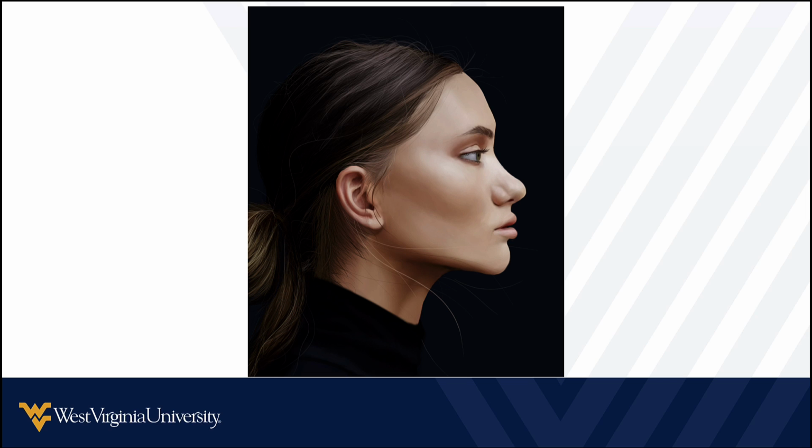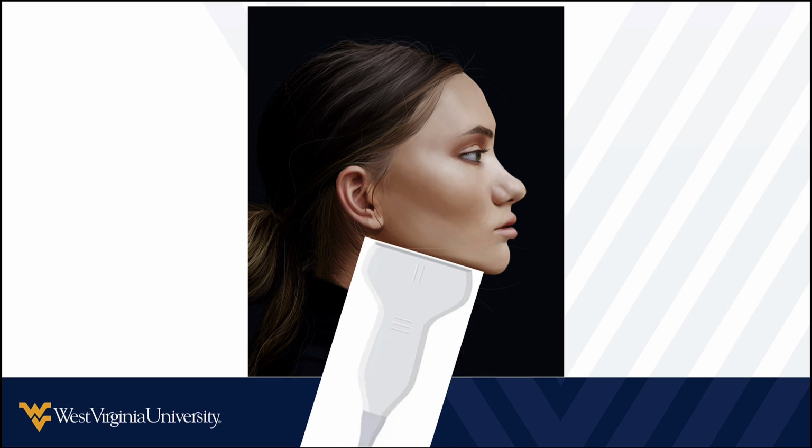So the technique for this is a submandibular approach, and you can use the linear or the curvilinear probe. It probably depends on how big your patient is or how much trouble you're having. Essentially, we come from the side and we bring the probe up just submandibular, and you're going to be under and medial to the mandible. So you're fanning in towards their neck or even slightly towards their trachea to try to identify this, obviously on the side that hurts.